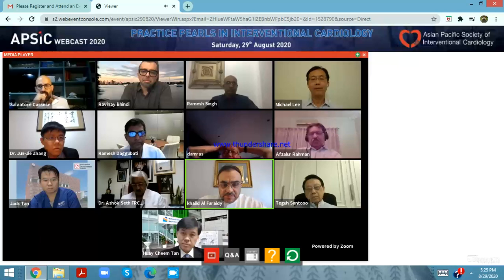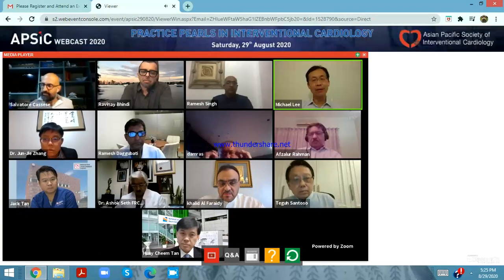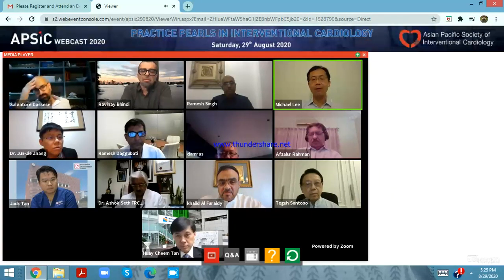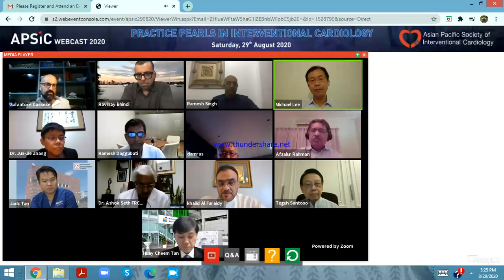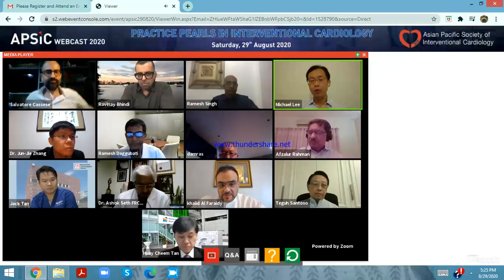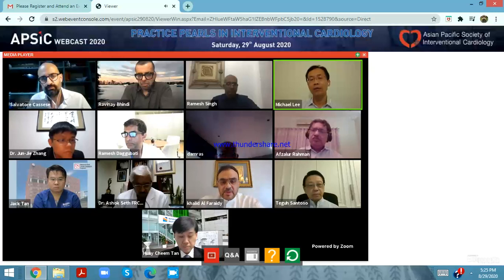That's my first question. We usually, depends on the size and the lumen of the vessel. If we think we can cross with the Shockwave balloon, then we would primarily use the Shockwave balloon. And if we see good results with expansion, we can go ahead and do stenting right away. But it's not a very good semi-compliant balloon to use, and sometimes it's difficult to cross. Then we might use a smaller NC balloon to first create a lumen for us to use the Shockwave balloon.